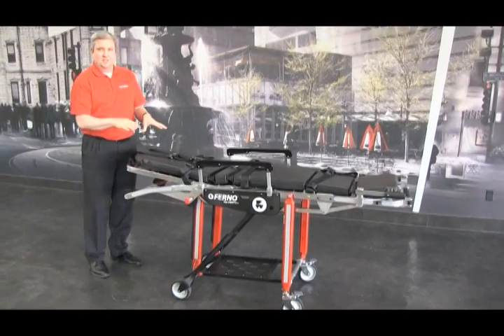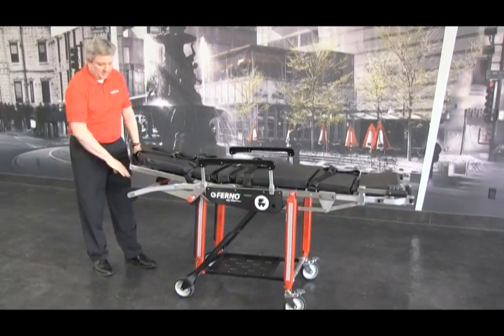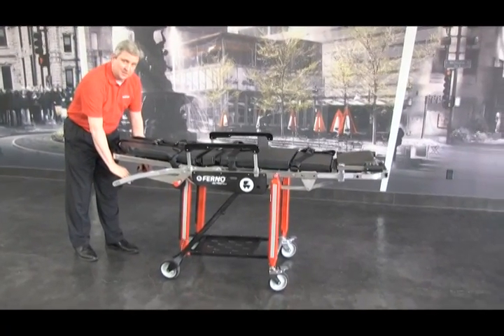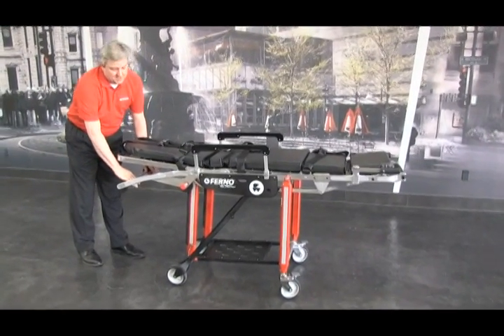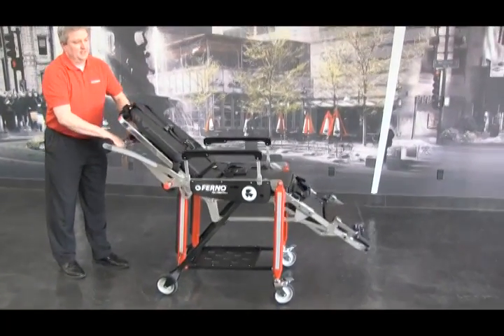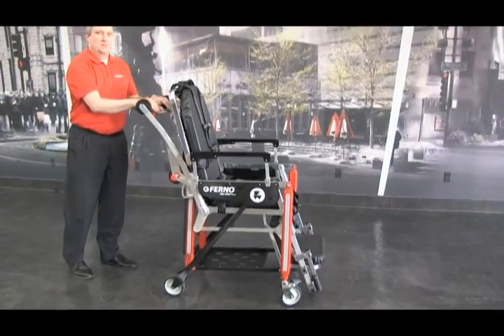To adjust the cot from the stretcher position to the chair position, the operator on the low end of the cot is to push down ever so slightly on the cot. This releases the pressure on the pin. Then pull the handle and adjust it into the chair position.